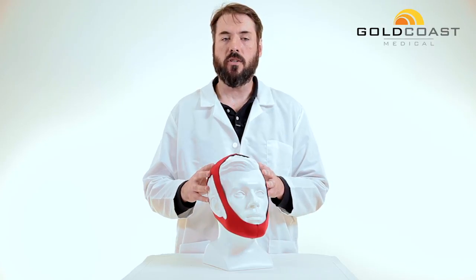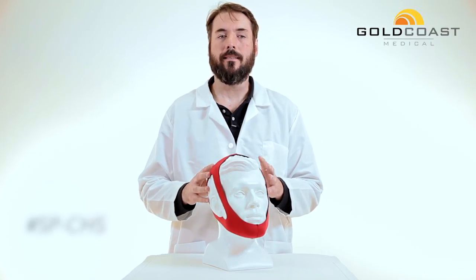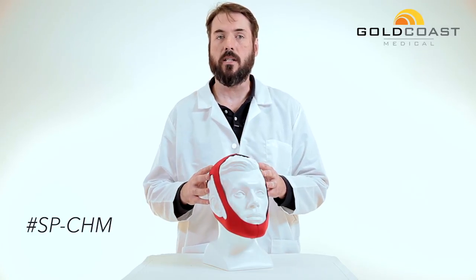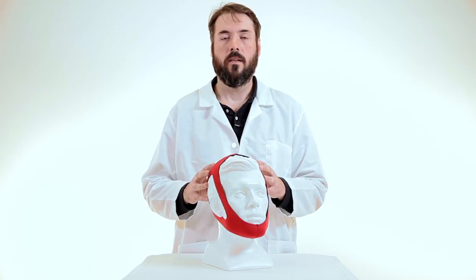Again, this is the CPAP chin strap. The size small is SP-CHS, the medium is SP-CHM, and the large is SP-CHL. Thanks so much for watching.